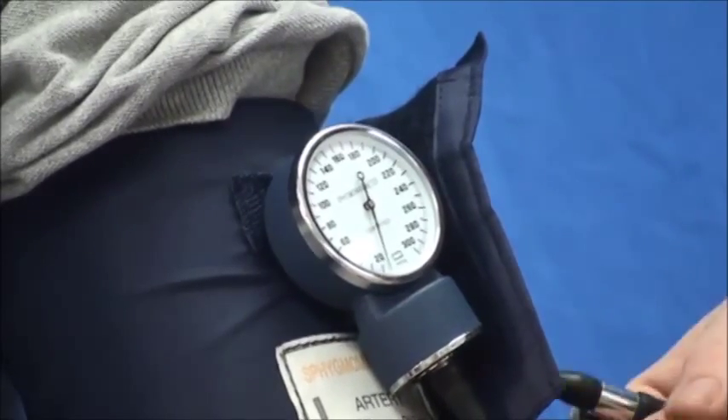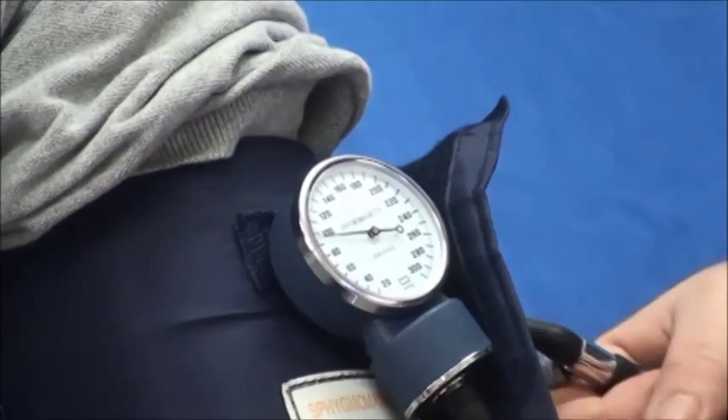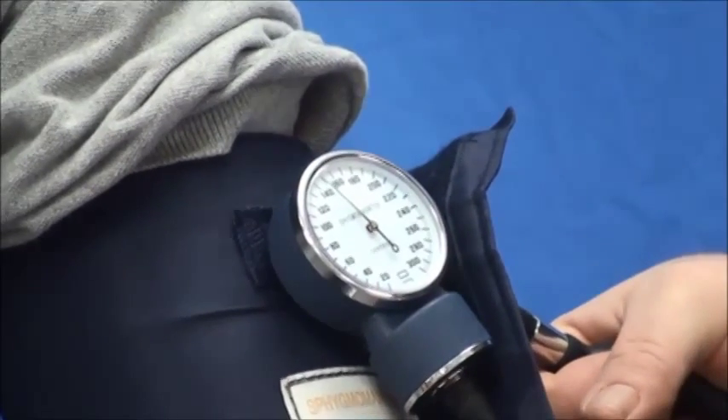So as I inflate, I can hear the pulse. It has gone away. I'm going to add about 20 to 30 more.